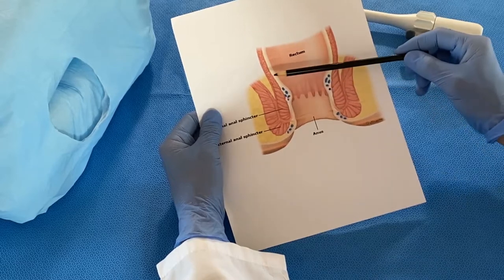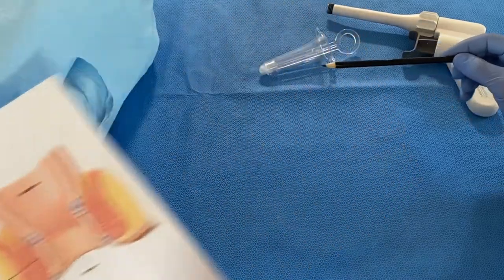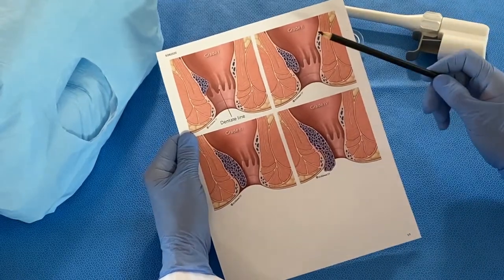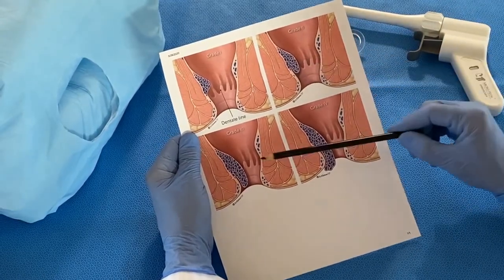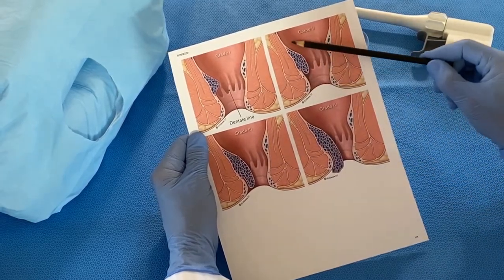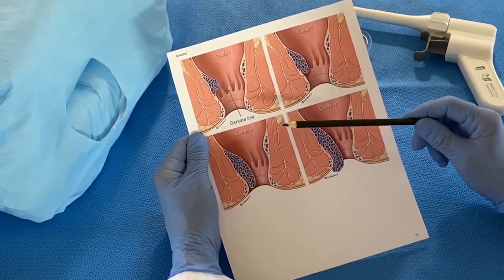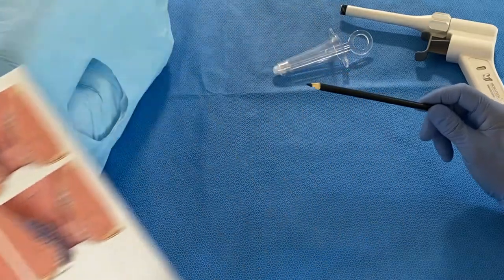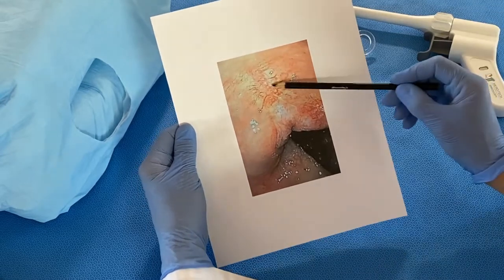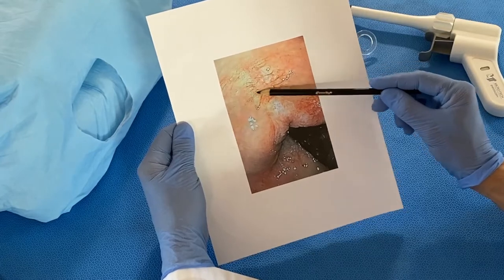Also remember that you do not band the actual hemorrhoids — you place the band just above the hemorrhoids at their base. You will most frequently band grade 2 and grade 3 hemorrhoids. The proper banding should be right here; it is important for the proper retraction of the tissue and scarring. This endoscopic picture with scars documents that the bands were properly placed above the dentate line.